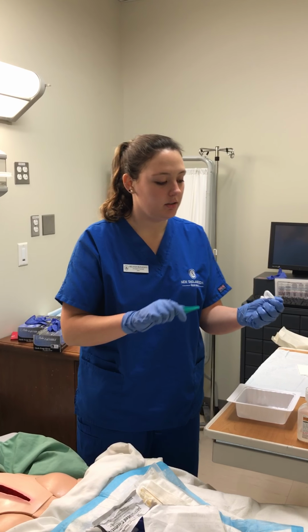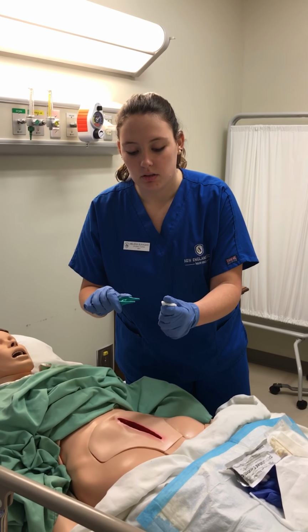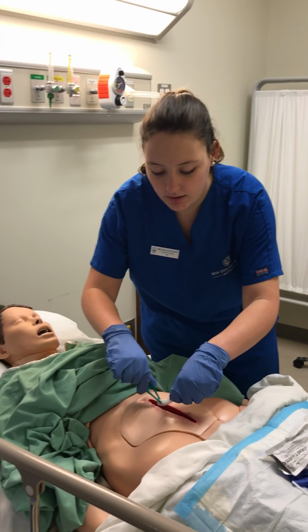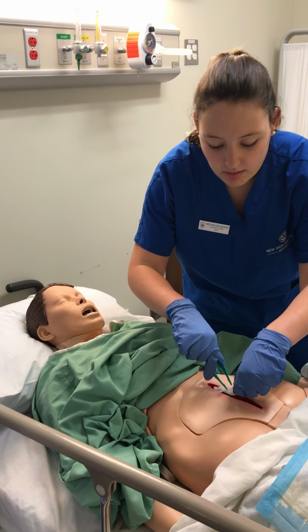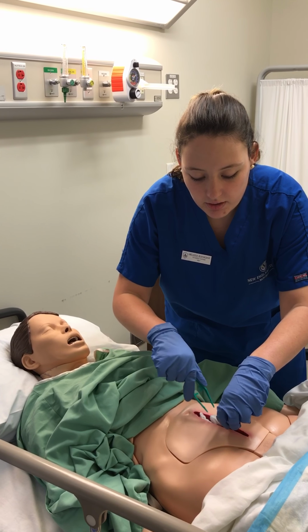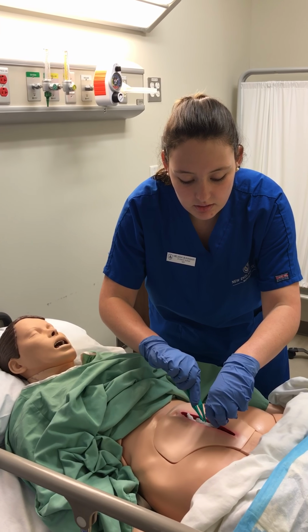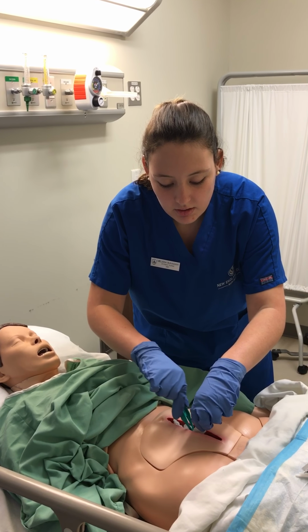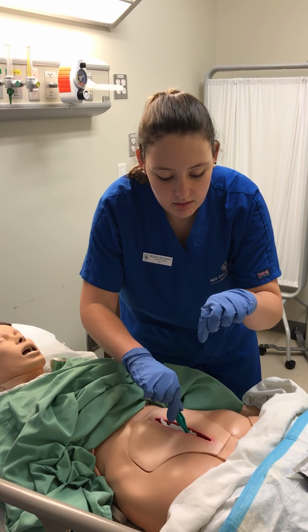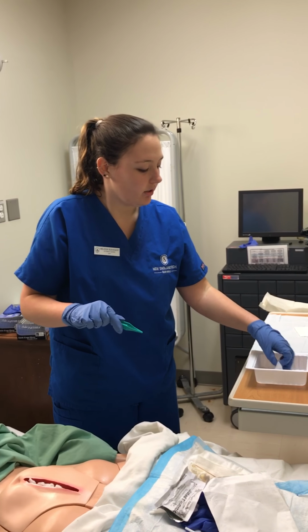Okay. Now I like to roll, okay? So I'm going to come over to my wound now. Once again, just going to feed in the 4x4 into the wound. Careful not to touch the outside. I'm going to repeat this with the other one.